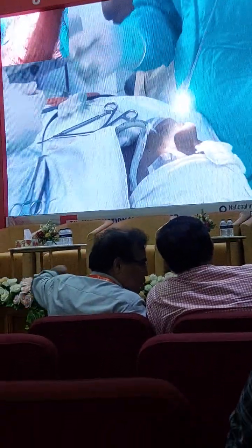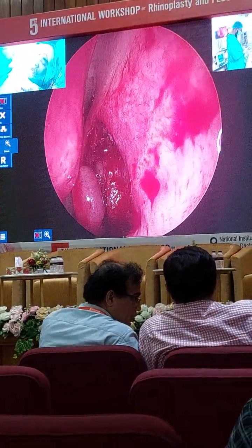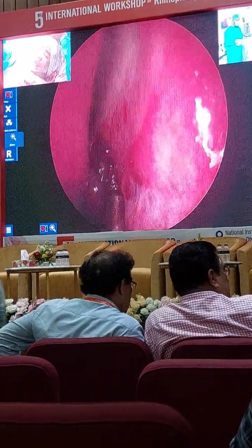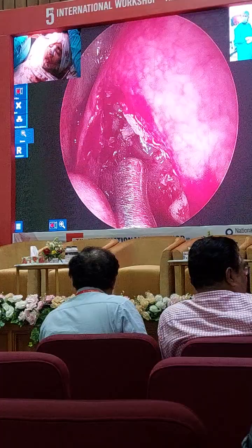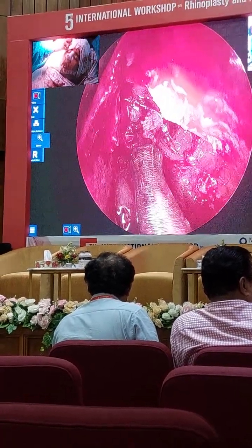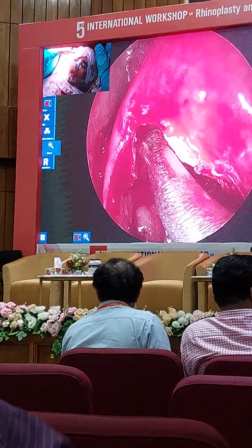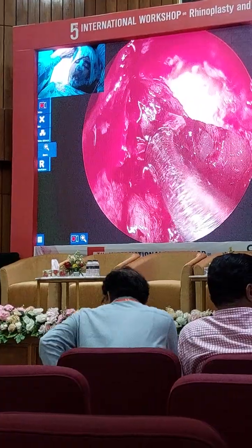Right? So when I go into the frontal recess area, initially I'm just using it as a probe with zero suction. So you see I'm here, there's no suction, unless I close my finger and get suction. So I can control it, and I don't want to suck in this area unless I have to, because suction in this area, especially on the way in, causes trauma.